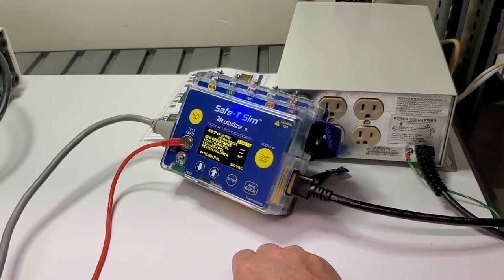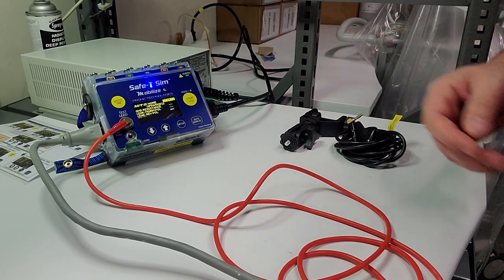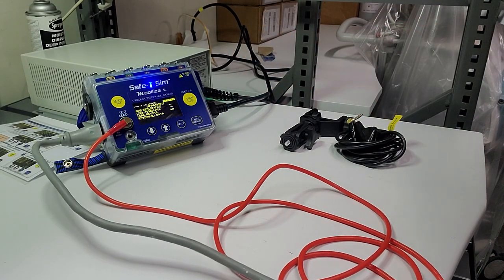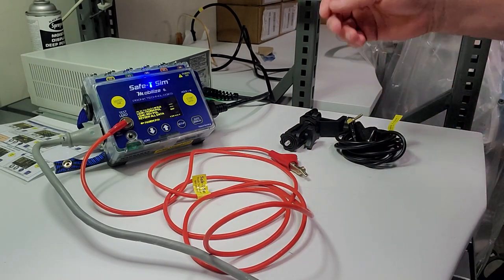I hit clear, exit, and we're out — it's ready to go to the next piece of equipment. We disconnect our ground lead, put it back, and press on to the next thing.